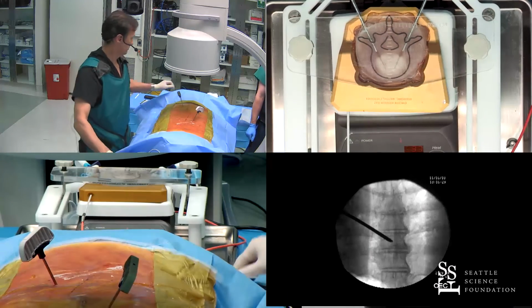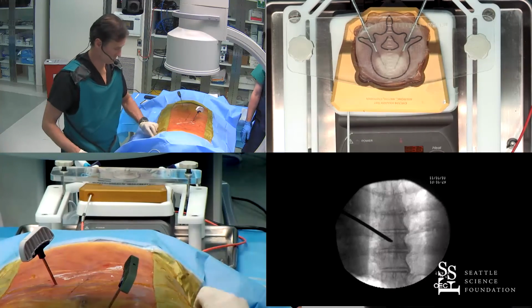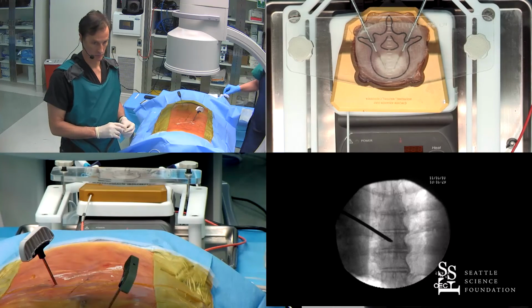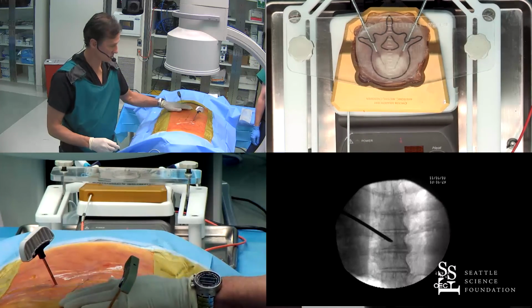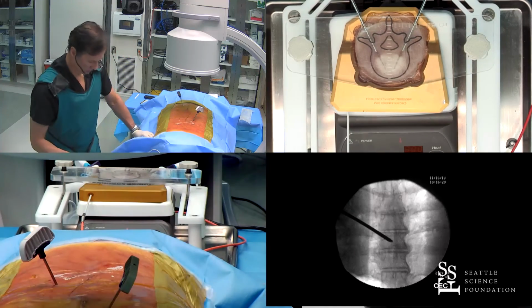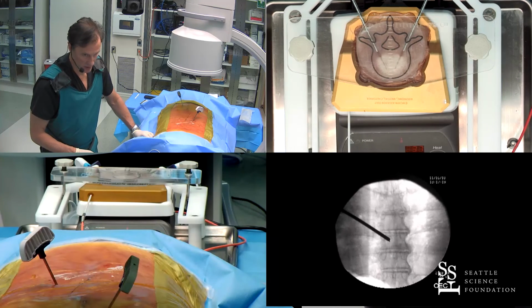I think one thing for the audience to note, if you'll note that Dr. Beall is always starting from sharpening the end plates at the level he's working at. For a lot of you who are just starting out, that's something really to make sure that you're working with the radiology tech to make sure that those end plates are sharpened before. Arc just a little bit towards you. So we're going to demonstrate the approach. We're going to arc a little bit more right there.